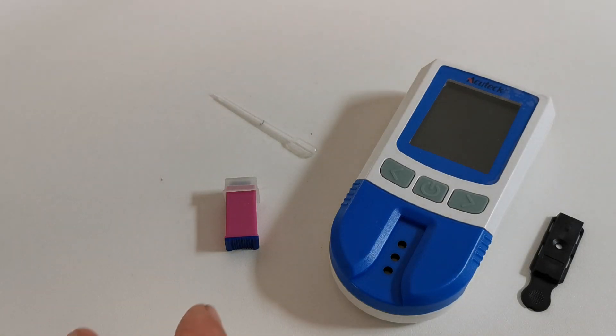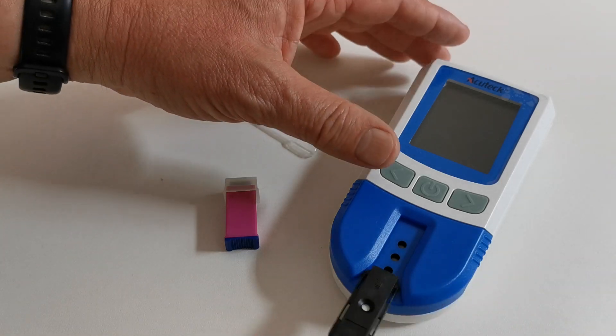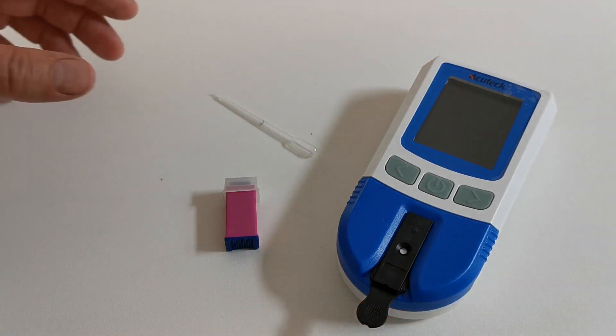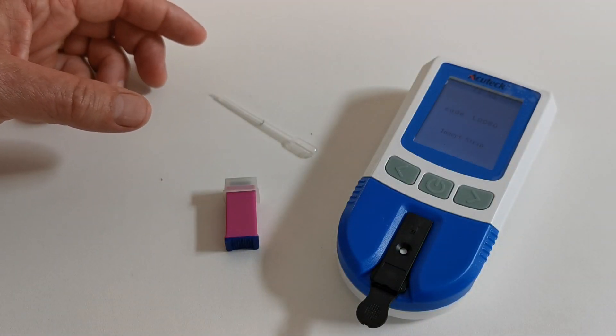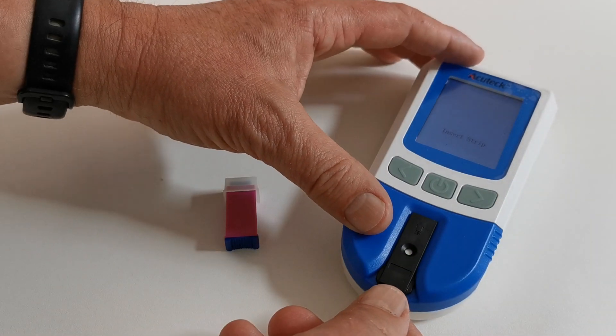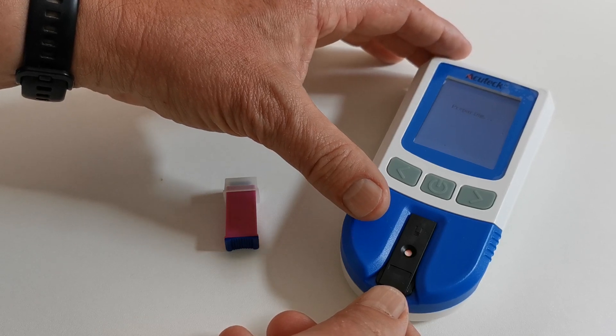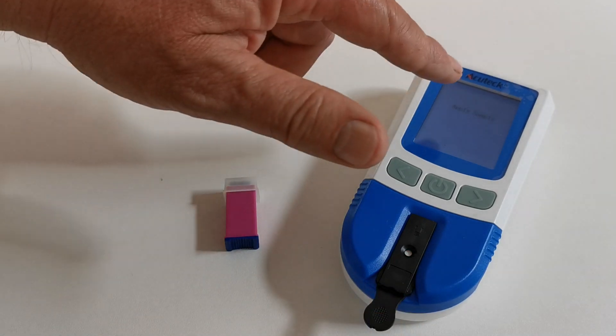When you've completed steps one and two, place the test device into your meter. It should automatically recognize the meter strip, and if the code chip is in place, it should prepare itself and ask you to apply the sample.